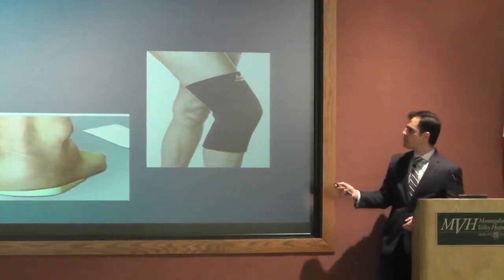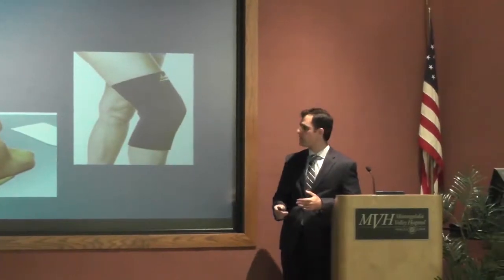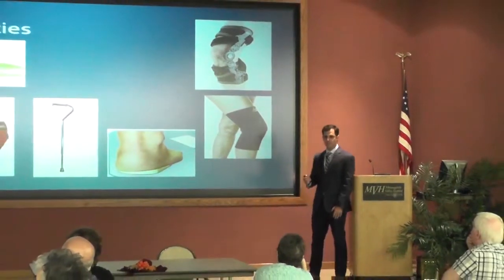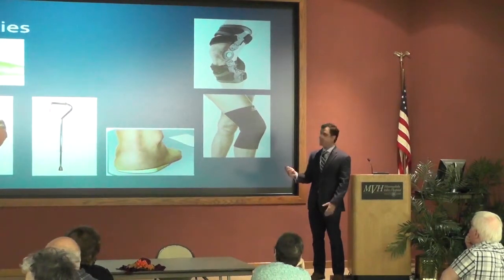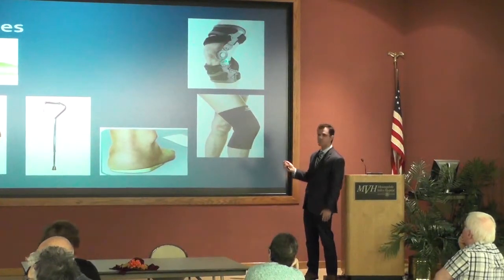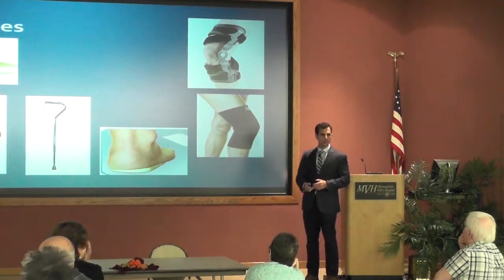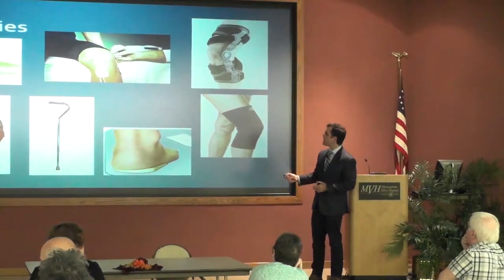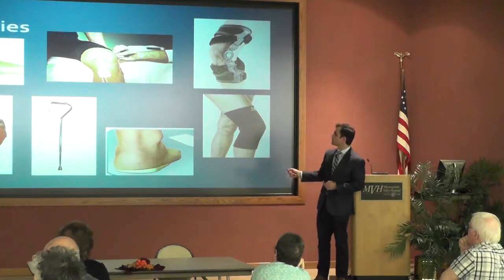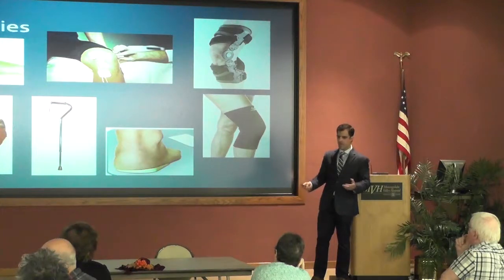Sleeves around the knee mostly provide a small amount of compression to the knee, give some warmth to the knee. So that can help people feel better. Bracing, so this actually helps provide stability to the knee, but the problem with it is it's pretty bulky, right? And if you have knee arthritis, a lot of times you get swelling and it's difficult for something like this to stay on. It does not mean you can't try it, it's just that's some of the problems with it. And then this is called TENS treatment, transcutaneous electrical nerve stimulation. These are pads that provide a light amount of electricity to the muscles around the knee and can get pain relief.